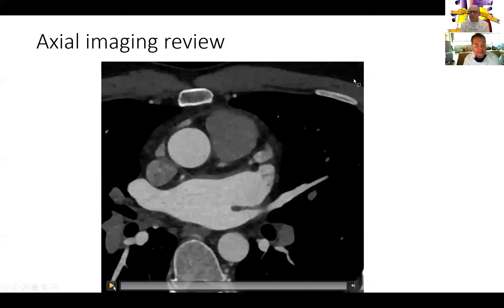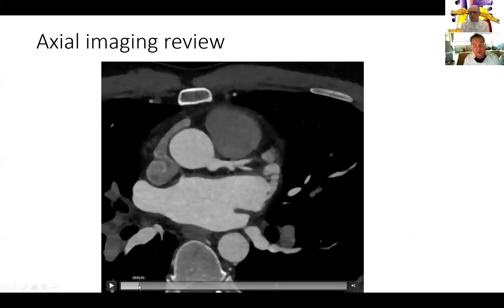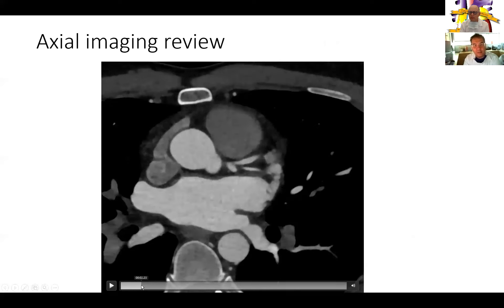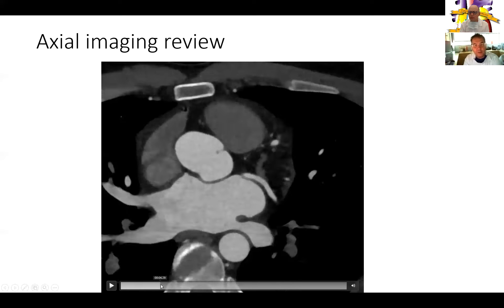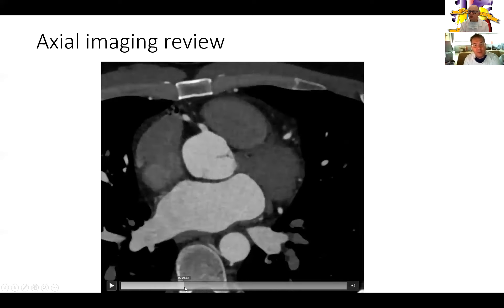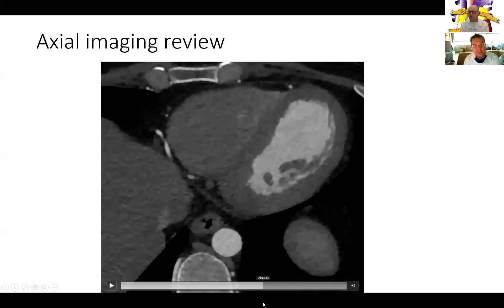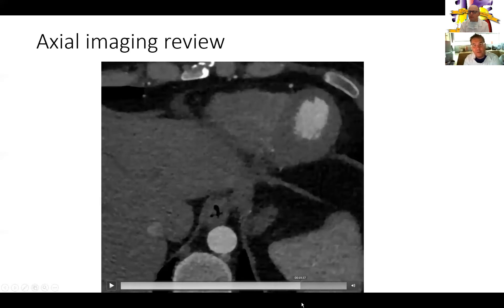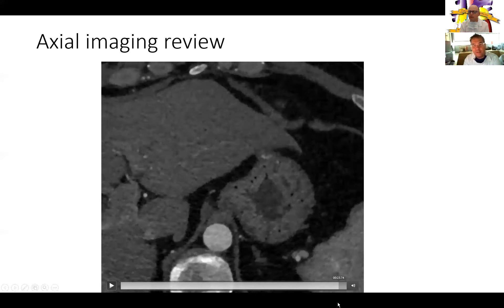This is an example of how to analyze in the axial images — you go frame by frame. Here I'm looking at the origin of the left main and how it trifurcates into the LAD, ramus, and circumflex. You go slowly and carefully, following the trajectory of the vessels. Then you have the origin of the RCA, and you can follow all these vessels to the distal branches. You'll see the distal RCA, and further up, the distal LAD wrapping around the apex. You go back and forth, each vessel at a time and each sub-branch at a time to look at the different segments.